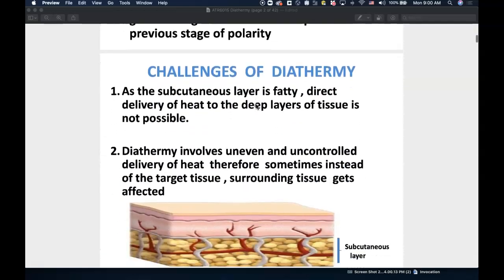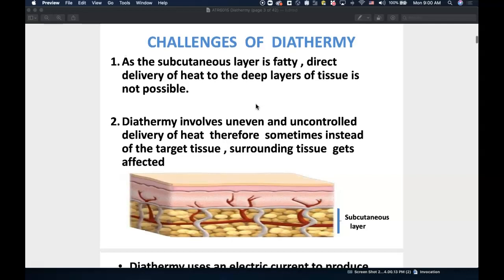Okay, so what are some of the challenges of diathermy? The number one challenge is actually finding a clinic that has a diathermy machine. But with that being said, physiologically, what are some of the barriers when we're applying diathermy, right? Can you guys tell I'm kind of excited about this? I don't know why, because you aren't gonna see it very often, but I get excited when I think about diathermy, because it truly is a deep tissue heater that's capable of heating large treatment areas. I just wish we had access to them. And we'll talk about why we don't in just a second.